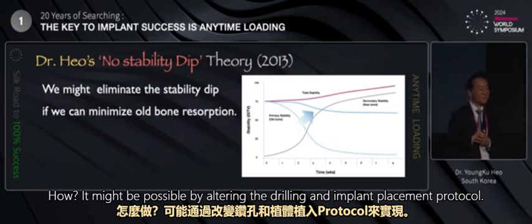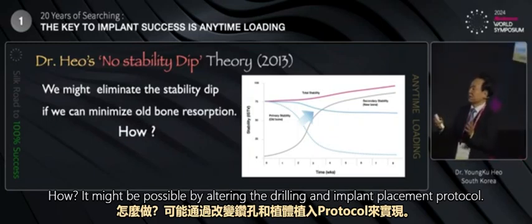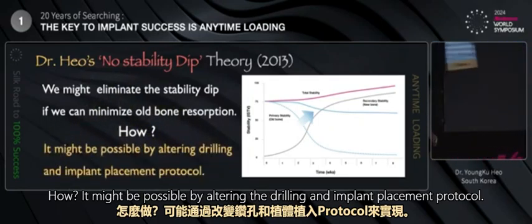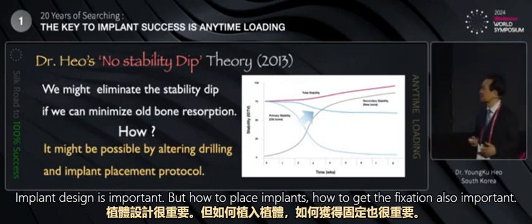How? Maybe it might be possible by altering the drilling and implant placement protocol. Okay, implant design is important, and how to place implants, how to get the fixation.